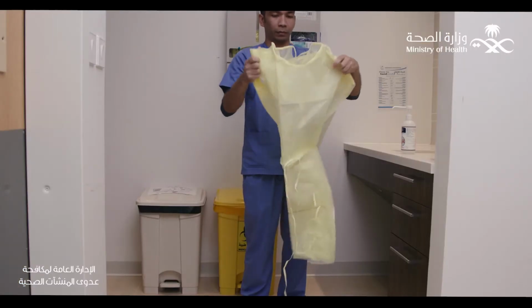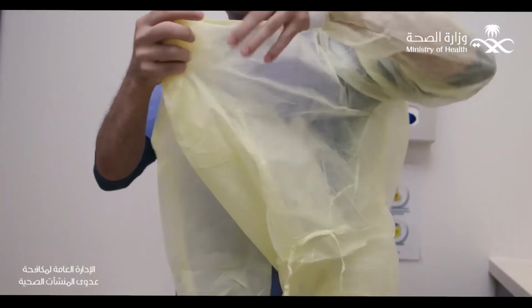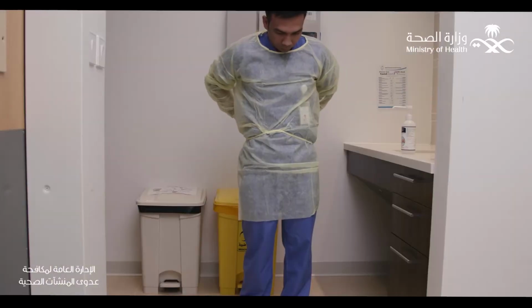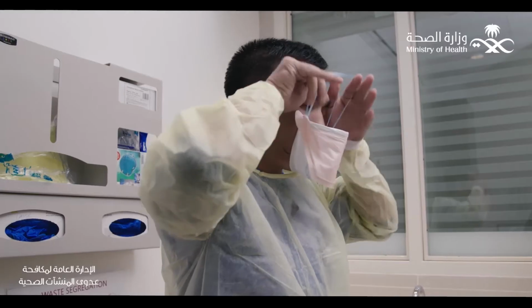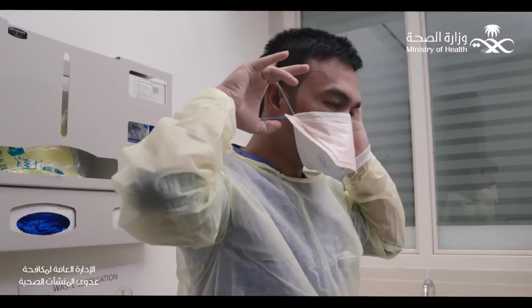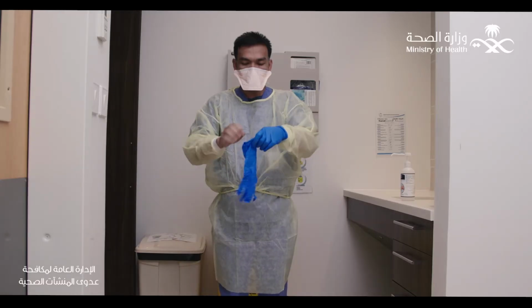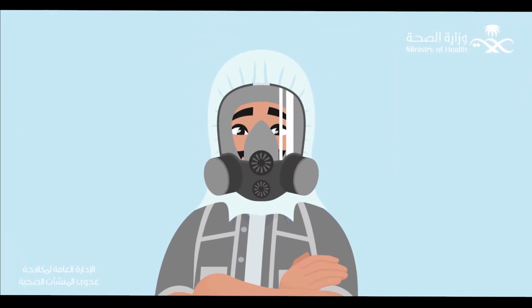The healthcare provider begins by wearing the personal protective equipment assigned to him, by wearing the yellow gown correctly. Wearing a high-efficiency respiratory mask suitable for him according to the respiratory fit test, then wearing single-use gloves, and in the event that the health service provider must have special equipment, which is an air helmet or hood, as a highly efficient respiratory mask does not fit bearded people.